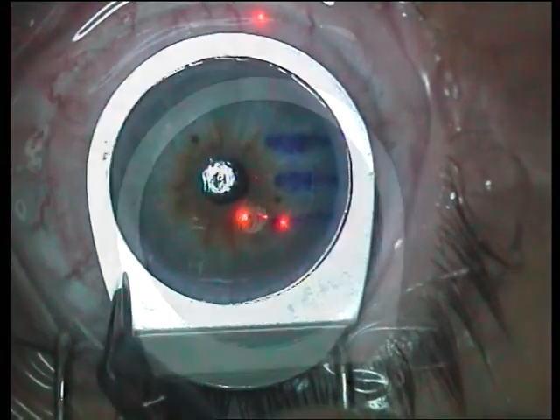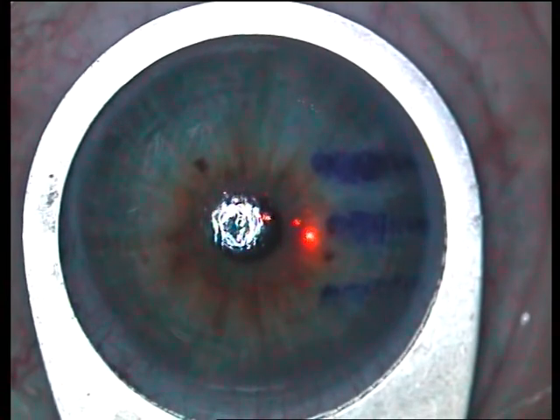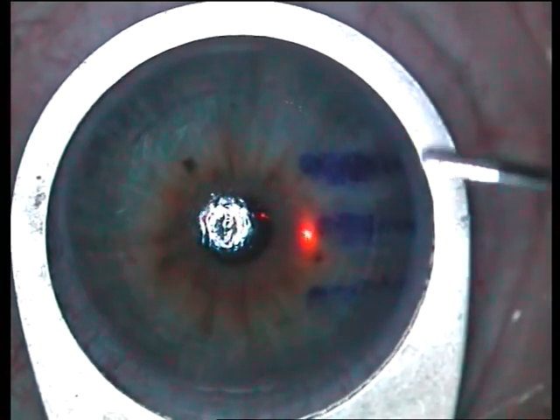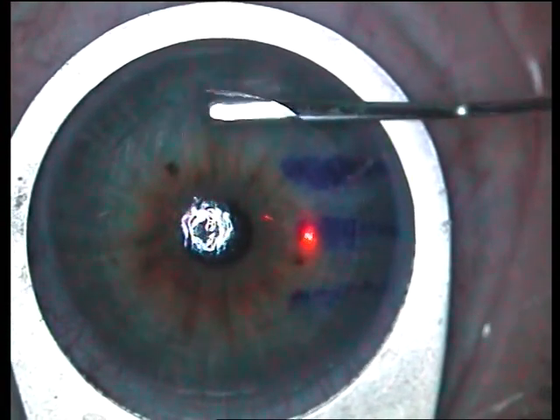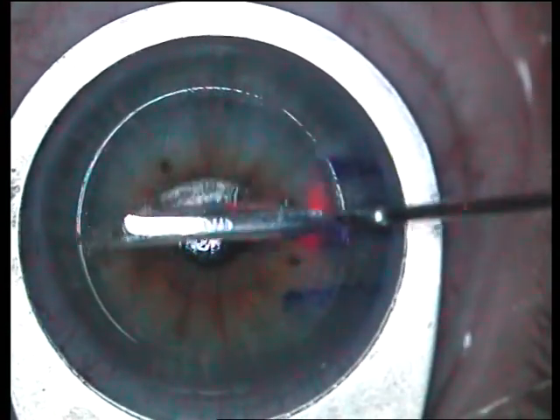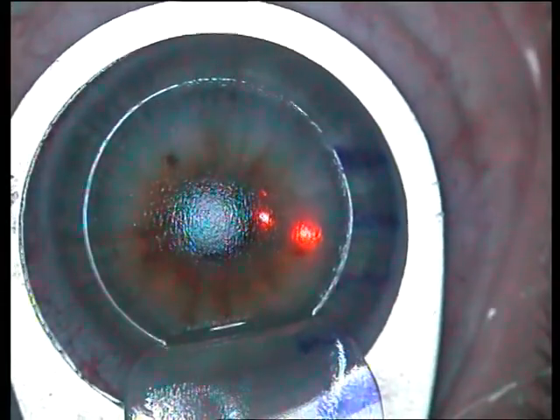The Banaji flap rest is placed on the cornea. The flap rest has a platform such that the corneal flap can rest on that platform at all times without being contaminated by any conjunctival secretions. The Banaji LASIK spatula is used to lift off the flap and rest it on the flap rest.